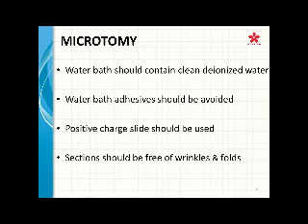We're going to talk about microtomy because the sections that you take are really, really important to immunohistochemistry too, of course. Your water bath should always be clean and just contain DI water, not tap water, because we don't know the pH of the tap water. So generally just using DI water. No bath adhesives. I know some laboratories do put adhesives in their water baths to help the tissue sections stick onto the slides. That can affect or alter immunohistochemistry staining.